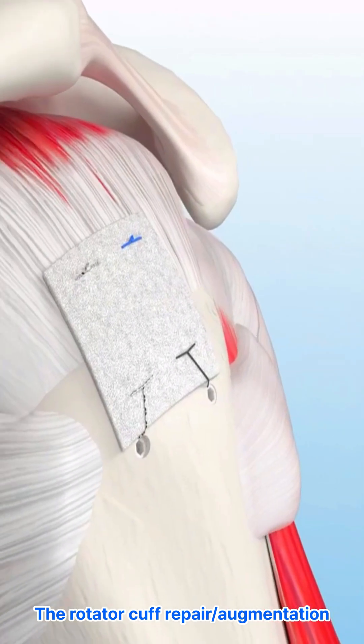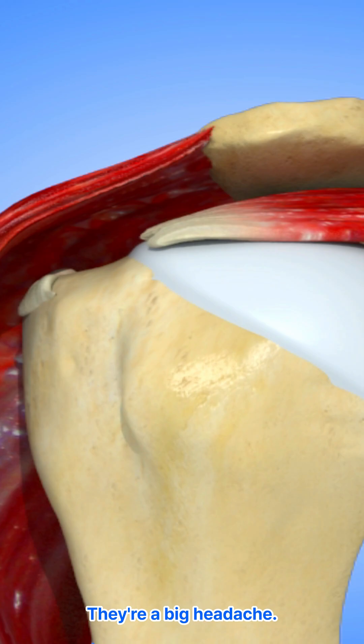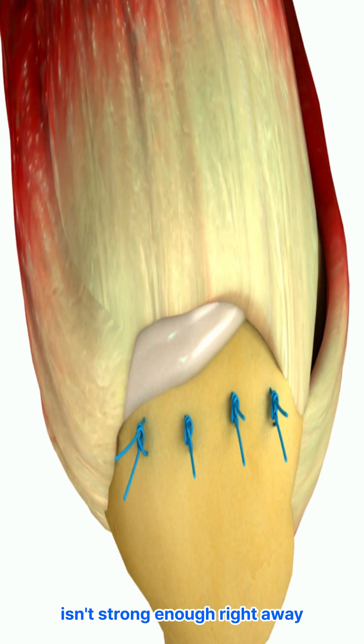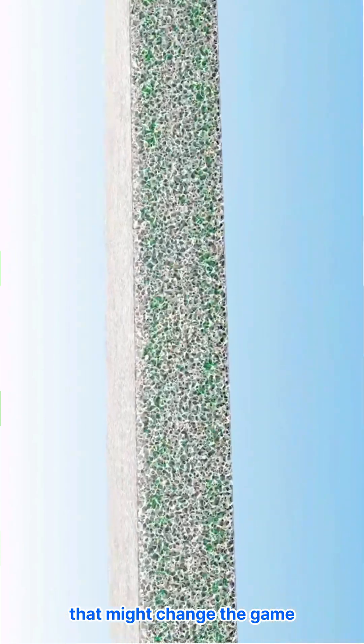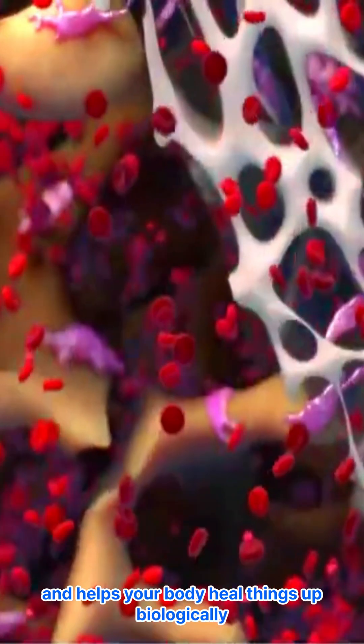Rotator cuff repair augmentation. Rotator cuff retears after surgery are a big headache, mostly because the initial fix just isn't strong enough right away. But there's this new biocomposite scaffold that might change the game — it brings both immediate strength and helps your body heal things up biologically.